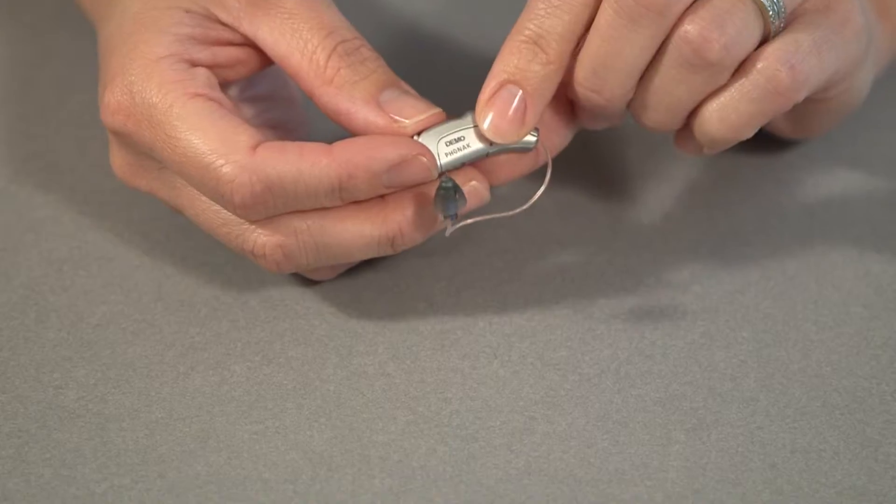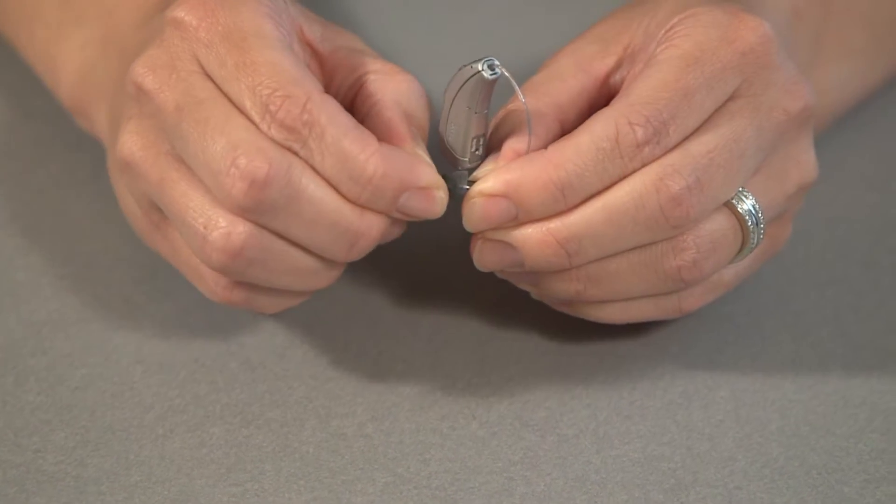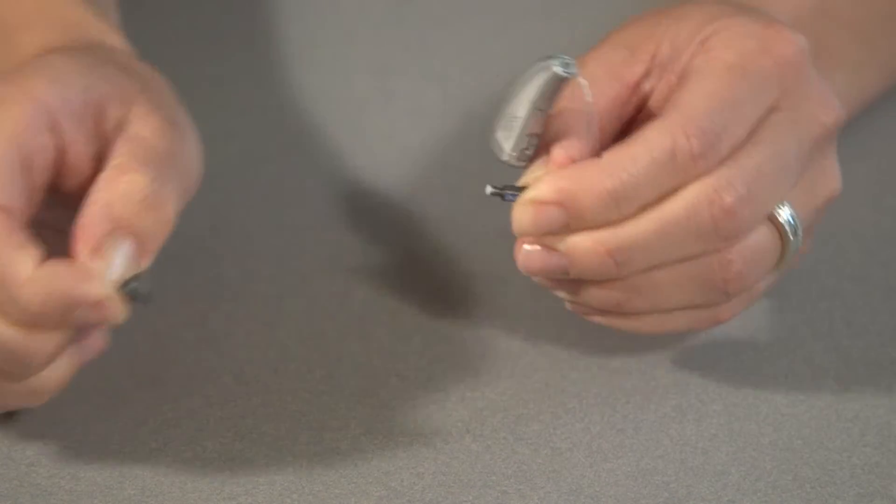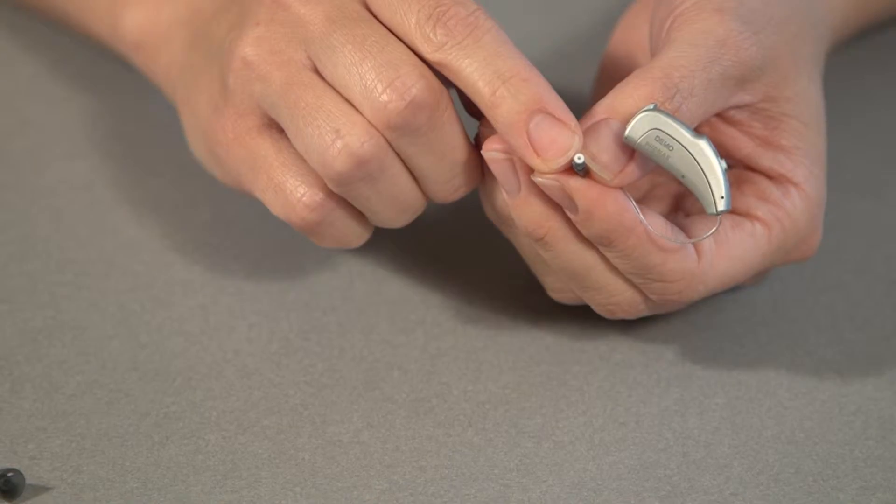And if the hearing aid still seems like it's not working properly, the next thing you want to do is pull the dome off the end just like this and replace the wax trap behind the dome.